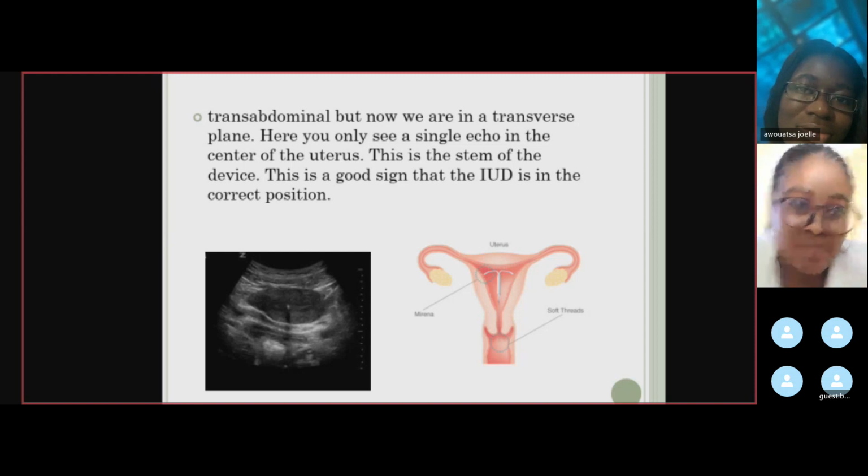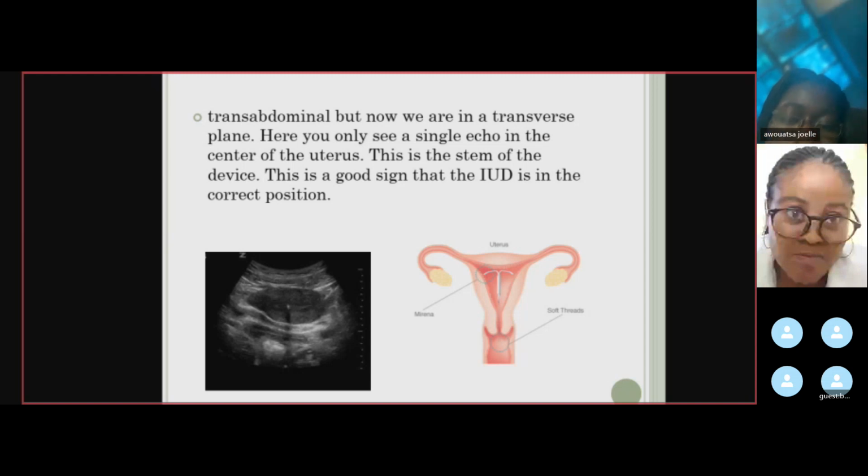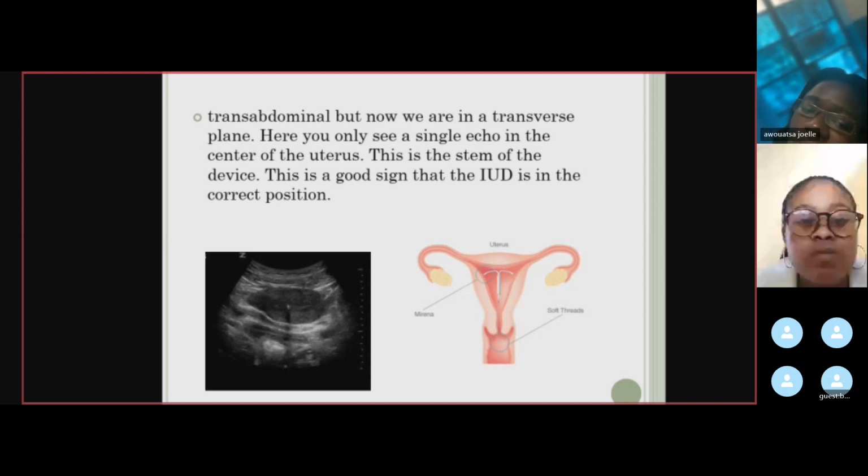Remember that whenever we are doing the gynac scan, it is not only to see the ovaries, and it is done for females. To see the uterus, and if there is any problem with the uterus, we do a gynac scan. For gynac scans, we have to tell the patient to drink water. Otherwise, we won't be able to see the ovaries.